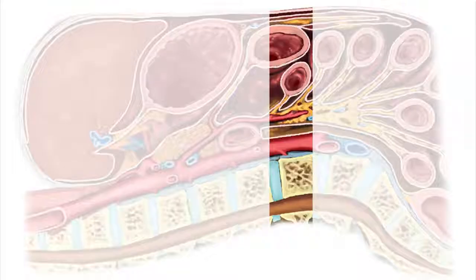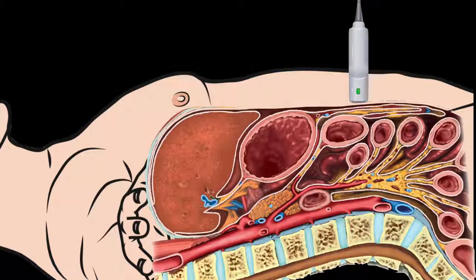The distal aorta is from when the SMA branches until the bifurcation of the aorta into the iliac vessels. This can also be done with transverse measurements, and it is ideally done in transverse as you no longer have the SMA to identify the midline of the aorta. So we're going to image in a transverse fashion, indicator towards the patient's right side, and we're going to look for a portion of the aorta where the SMA is no longer in view, but proximal to the iliac bifurcation.